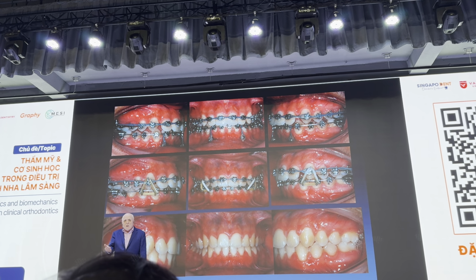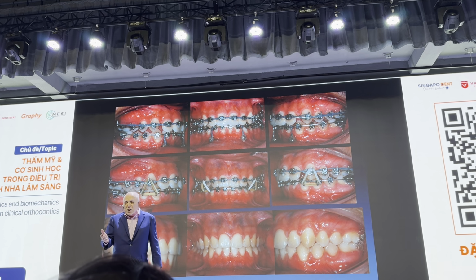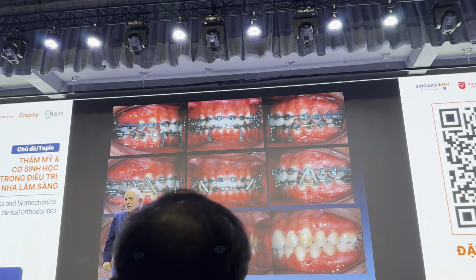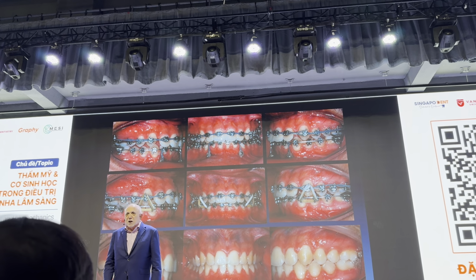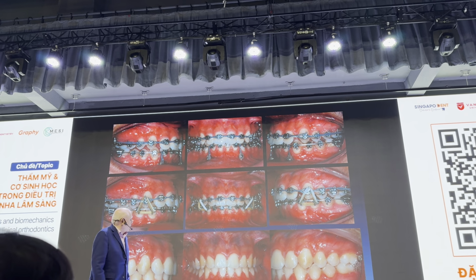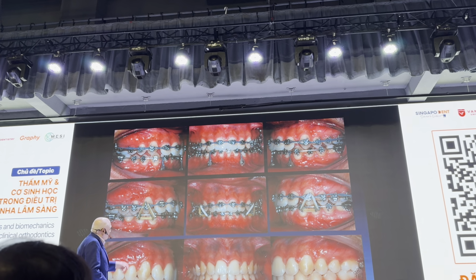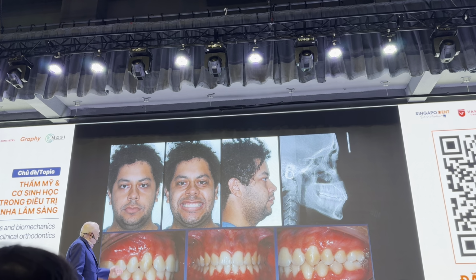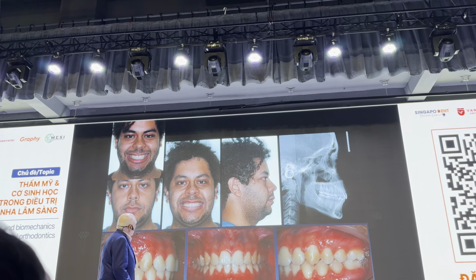So how do you learn from your own patients? You got to take pictures before, during, and after. And then you look at them, and then you say, oh, next time I'm going to do something better. And I do better. So that you can see the tags have been used very effectively in this patient to fix the midline without too much of a problem.